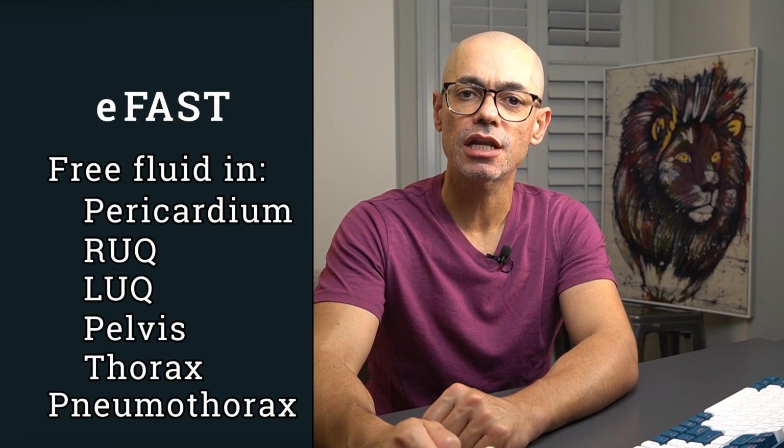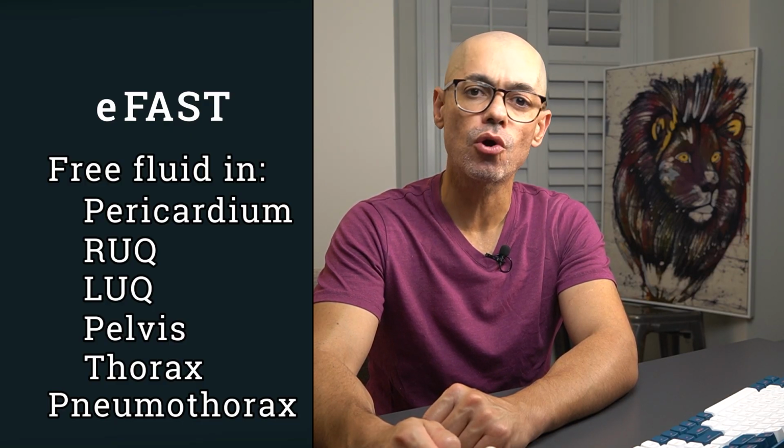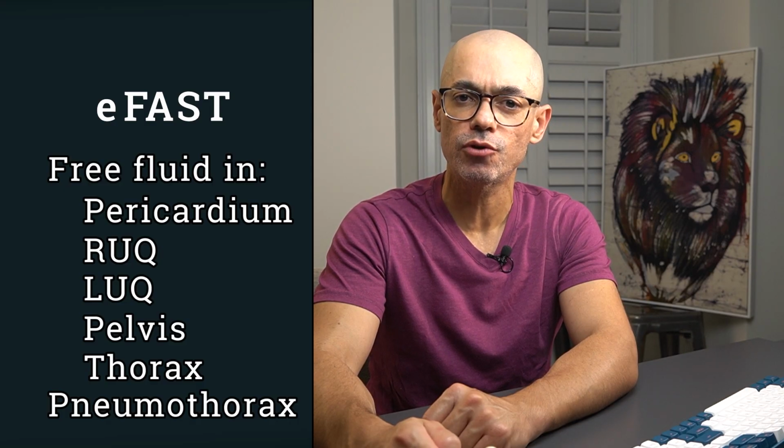The FAST exam involves an evaluation of the abdomen for free fluid, pericardial fluid, and assessment of the IVC. For purposes of the OSCEs, our goal is to focus on identification of free fluid in the abdomen. I explore these other areas with their respective lectures as part of this series.